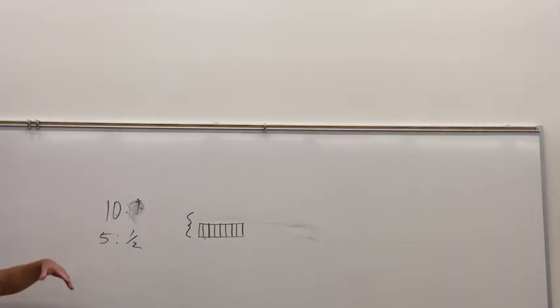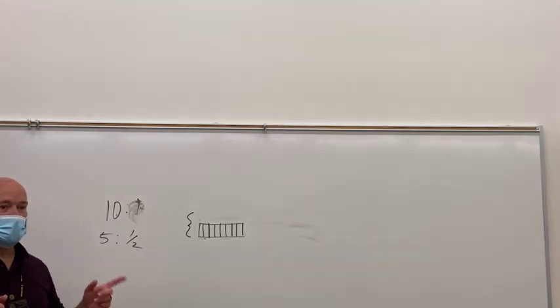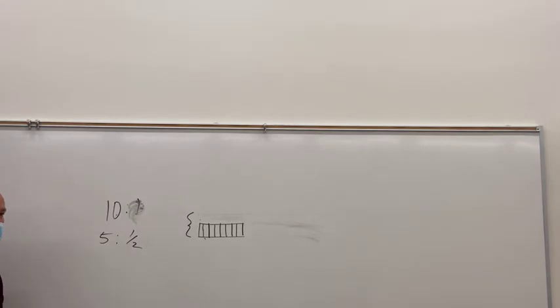What is a 5 to 1/2 compared to a 10 to 1? They're identical, right? So our grid ratio remained the same, but we got an increase in grid frequency. So we can manipulate grid frequency and maintain the same grid ratio and overcome that raster or moire artifact that we were talking about before.